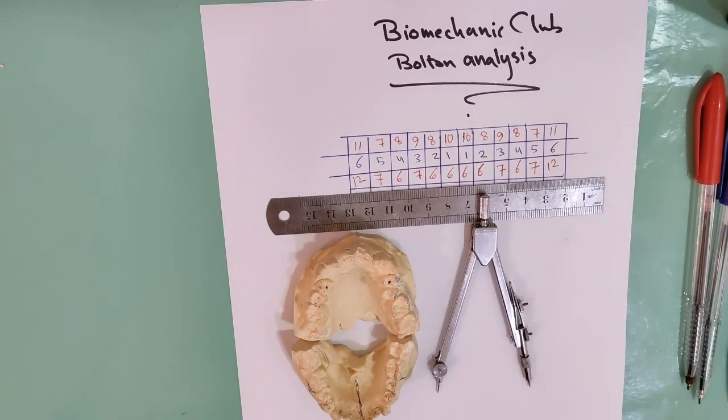Today we are going to do Bolton analysis, also called tooth size discrepancies. With Bolton analysis, we can measure the discrepancy between the upper and lower teeth. Bolton analysis is divided into two parts. The first part we can call partial Bolton or anterior ratio. The second part is the full Bolton, and we can say overall ratio.